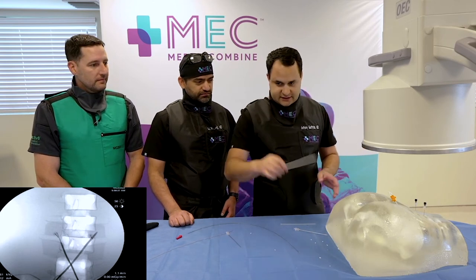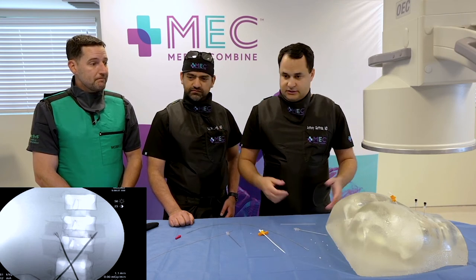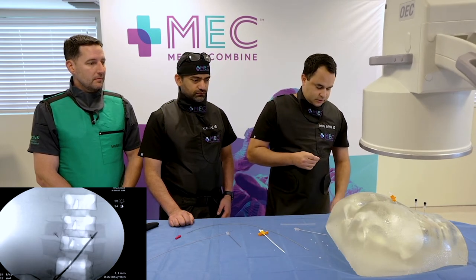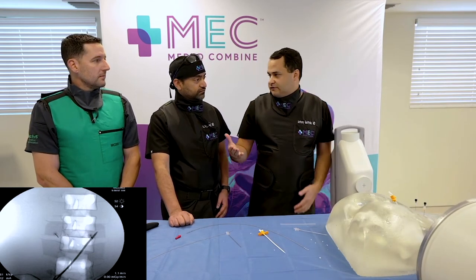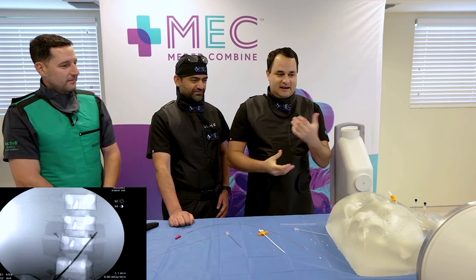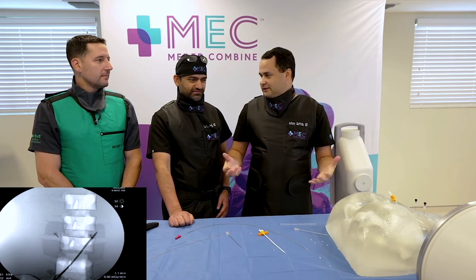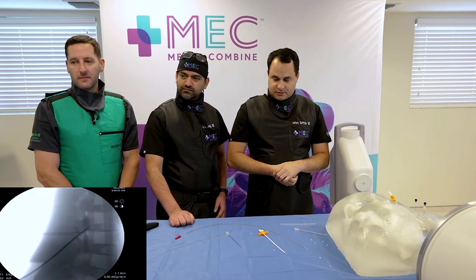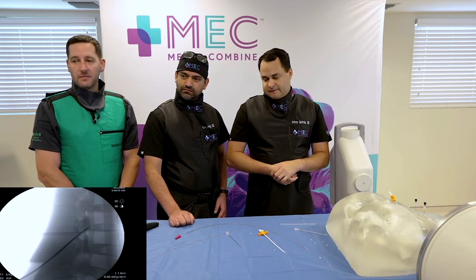Now on the right side — I want to make sure the sheath is still pointing at the L2 vertebral body in lateral view. If it's one of your first cases — imaging is your friend, time is your friend. There's no record you're trying to break. Take a few more images, lateral and AP. You don't want to throw the lead in and have it not stimulate the nerve because you're a little posterior and missed it. We want to be going right at that inferior border of L2.